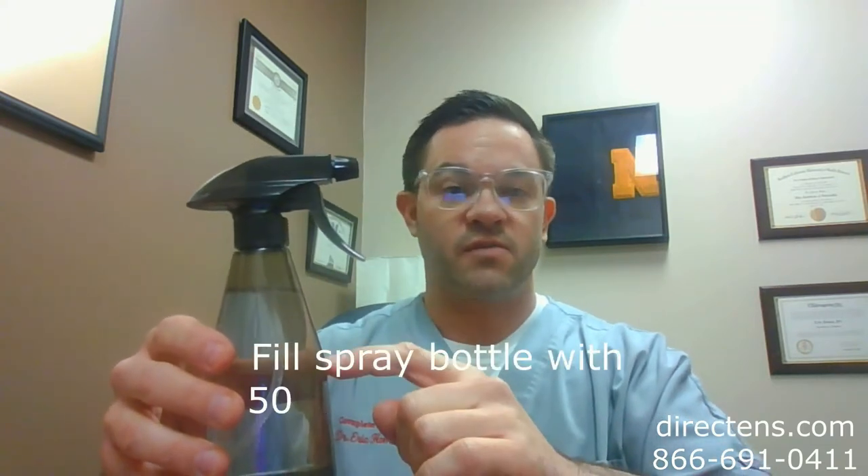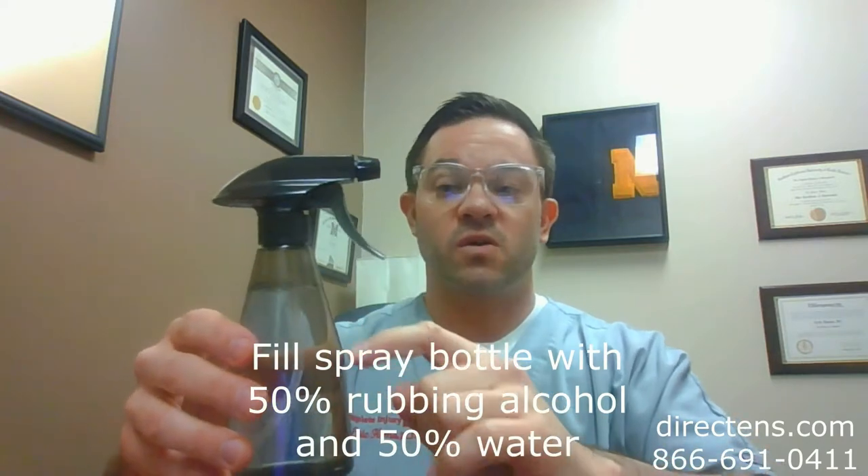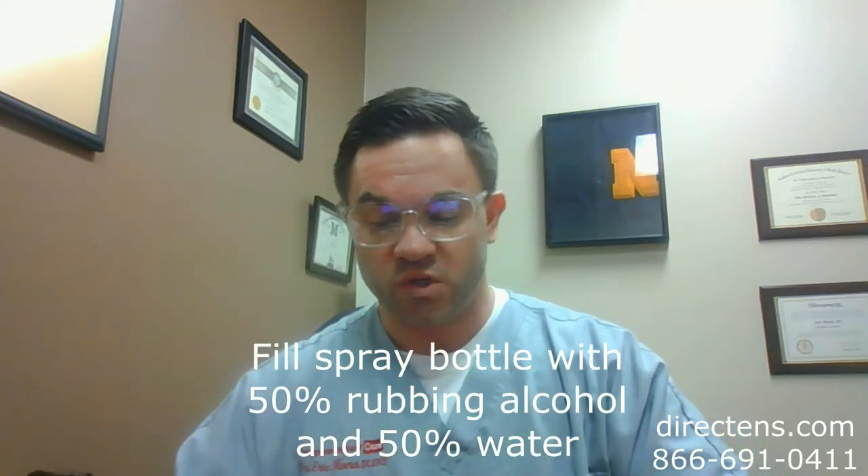Generally, the electrodes are going to come on a little piece of plastic like this. The ones we use in our office are given with an alcohol pad that looks like that, so you can use those to clean them. But we're going to look at how to do it the old school style. What you're trying to do is keep these from drying out, which will keep their stickiness. So you'll take a water bottle like this one and fill it with half rubbing alcohol and half water.